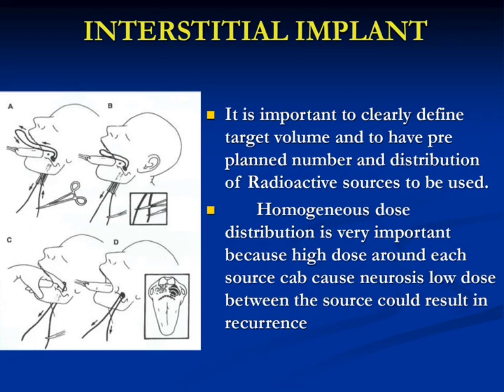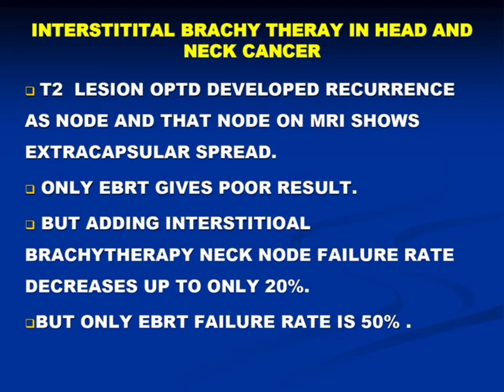You must know the source movement, a combination of various source trains with options to choose. The small miniature sources with a spacer enable the operator to create his own source configuration. So with a single source, with the option of different dwell times, you decide how much dose is to be delivered to different sites at various positions, simulating either one or many multiple source points.